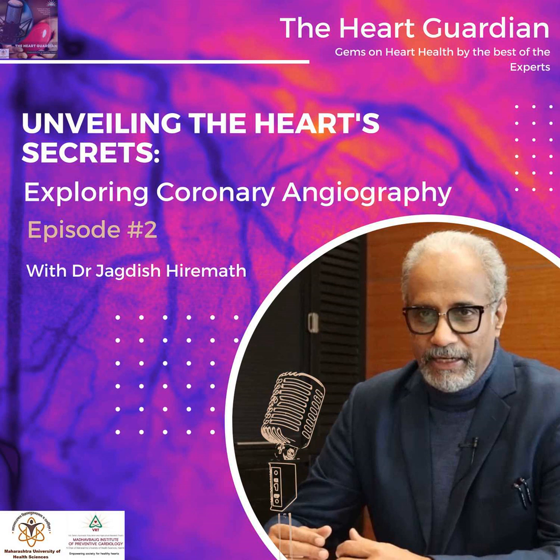If one wants to study the blockages, a photograph of the heart from outside is of no use. What we need to have is a pipeline visualized. The bore or lumen of the coronary arteries should be visualized, and this test is known as coronary angiography. The current best-in-world technology can visualize the bore or lumen of the artery by X-rays or by CT scan. In both these methods, blood inside the coronary arteries is made opaque so that the flow can be studied.